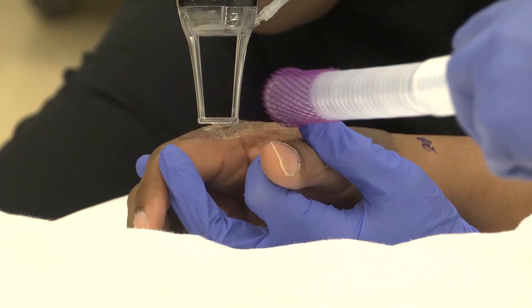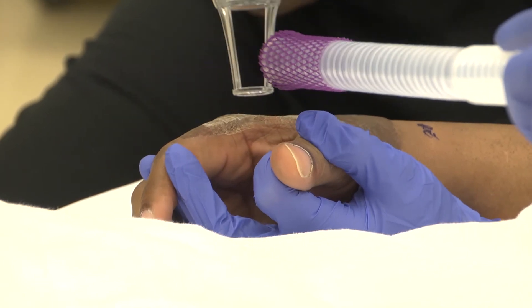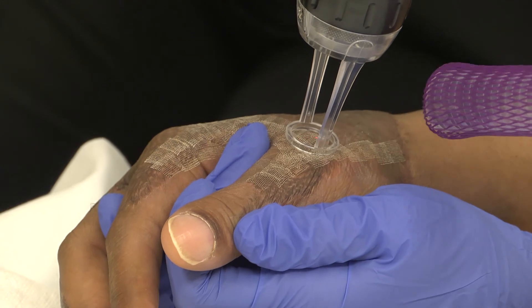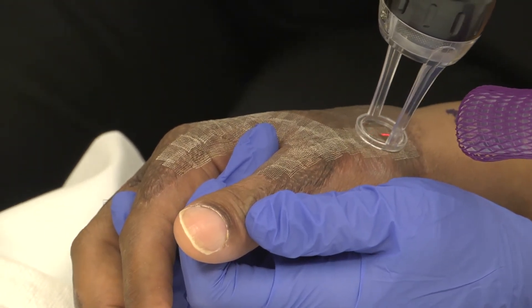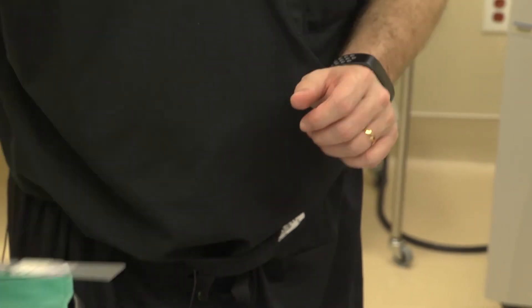Our nurse practitioner, Renee Edkins, is applying the laser sequentially. After we're finished creating these holes in the skin, we're then going to use our steroid cream and massage it into the skin to help soften it up.